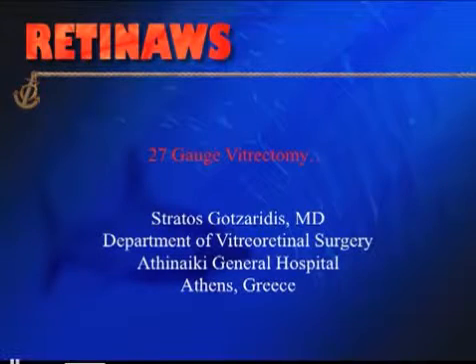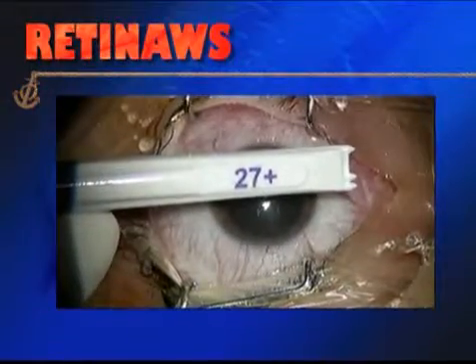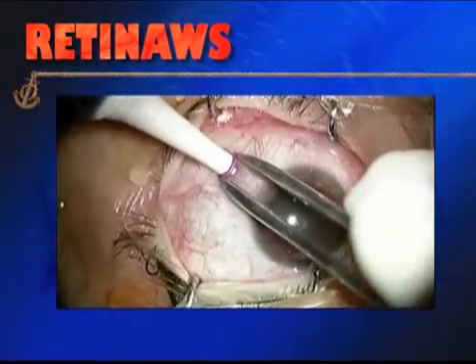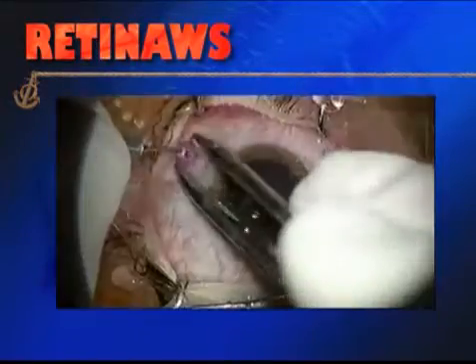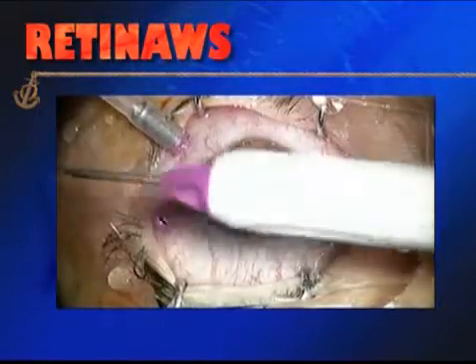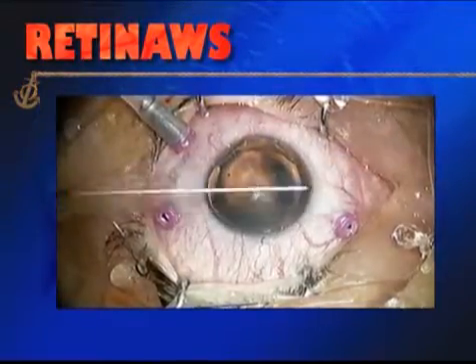So we have one more case on 27-gauge vitrectomy stratus. This is my first case, my first experience with 27-gauge. It's a macular hole. You see the instruments, the sleeve around the instruments that make them stiffer than they used to be before, with the first trial. Well, the vitrectomy took me longer.